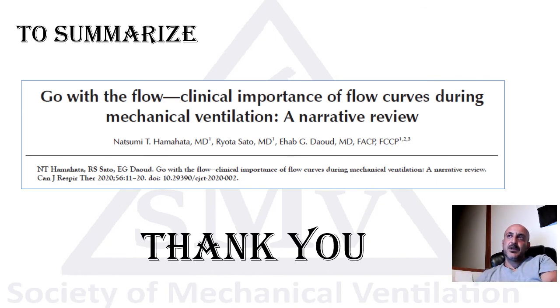So this is the article that I talked about at the beginning of the talk. We published it in 2020 in the Canadian Journal of Respiratory Therapy, called Go with the Flow. At that time it sounded like a catchy, nice name. Now I don't think so. It sounds a little bit silly. Anyway, clinical importance of flow curves during mechanical ventilation. And hopefully it gives you an idea and explains everything a little bit more clearly.